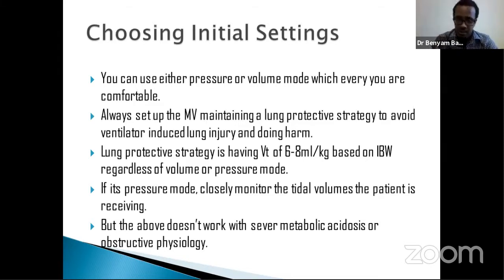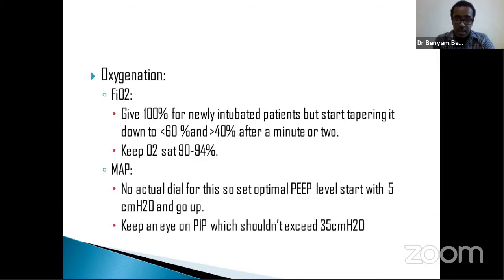normal patient, or a patient with no lung pathology, or a patient with lung pathology, be it ARDS, cardiogenic pulmonary edema, pneumonia, and other lung pathologies, you may use it, but do not use it for severe metabolic acidosis and obstructive pathology. So for initial settings, as I said, calculate the tidal volume.